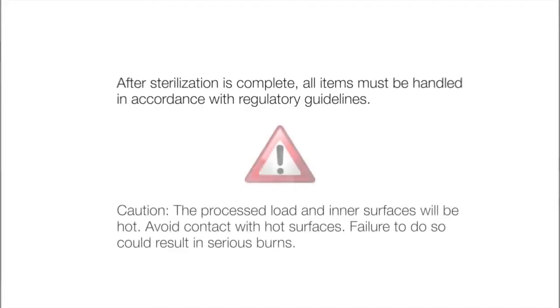After sterilization is complete, all items must be handled in accordance with regulatory guidelines. CAUTION: The process load and inner surfaces will be hot. Avoid contact with hot surfaces. Failure to do so could result in serious burns.